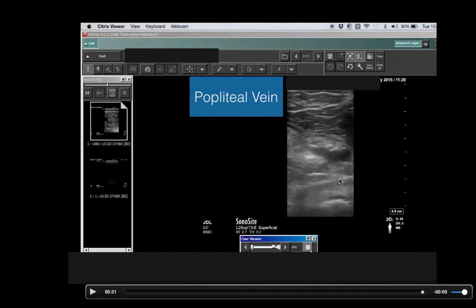And he went for a formal ultrasound, which identified a clot in the TP trunk. You can also see how that is not as dark as what you would imagine the vein should look like. So that's, I think, a clot right there.